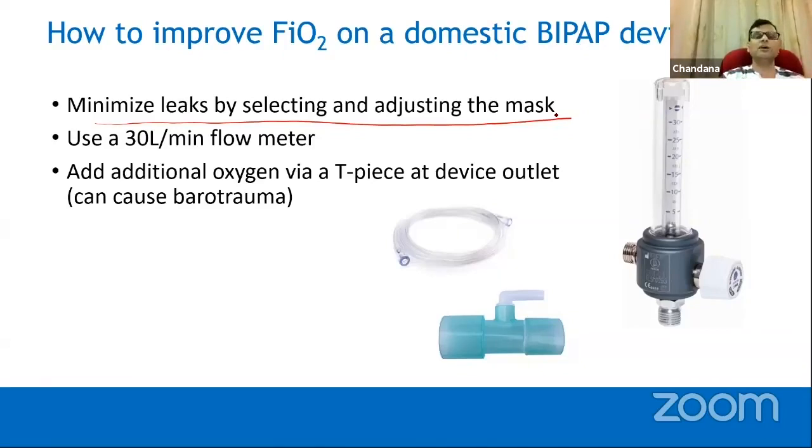in an actual situation. Somebody can say that you have to go in and adjust, but who is going to go and adjust? That is a practical problem. But one thing you can do is explain to the patient when they are in a fairly okay situation, before they become quite bad. You can explain how to adjust the mask and the importance of keeping the mask. But once they are sick, they won't listen to you, and it's a difficult task. Anyway, it is important to have a properly fitting mask with minimum leak.